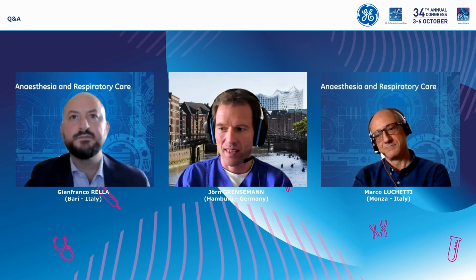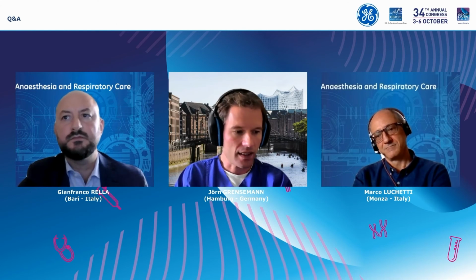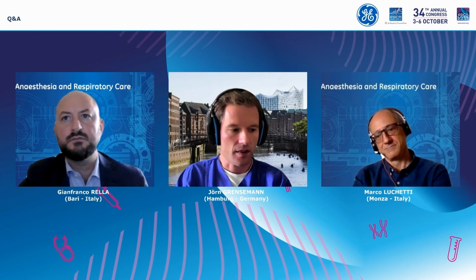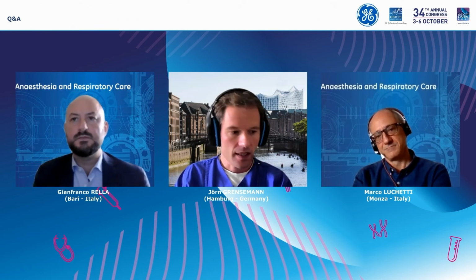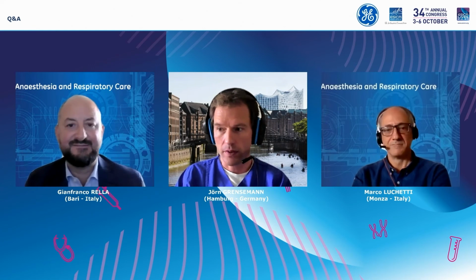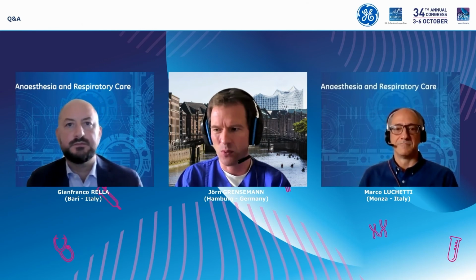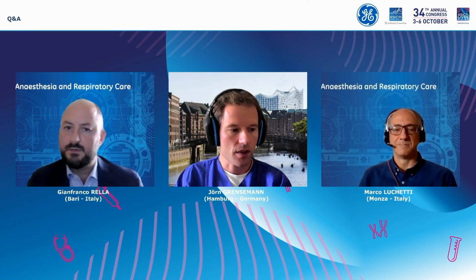So it's a little bit like the measurements only by carbon dioxide release I've shown you, and the same is true for this method. There are data from the late 80s and 90s that could show at first a very good correlation with indirect calorimetry, but on follow-up studies, this concept didn't work that well.